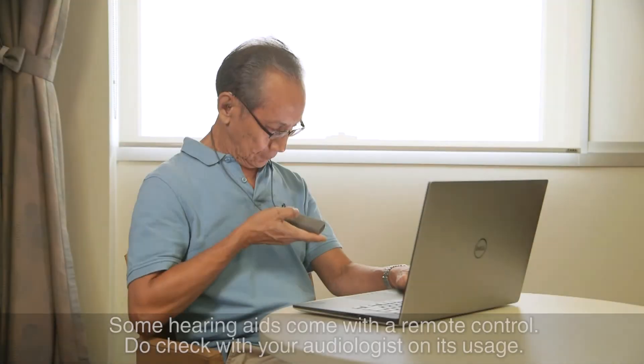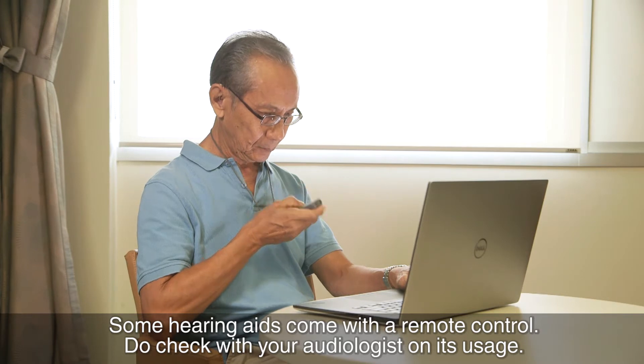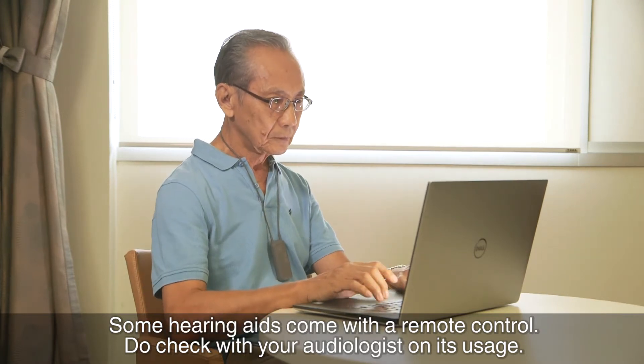Some hearing aids come with a remote control. Do check with your audiologist on each usage.